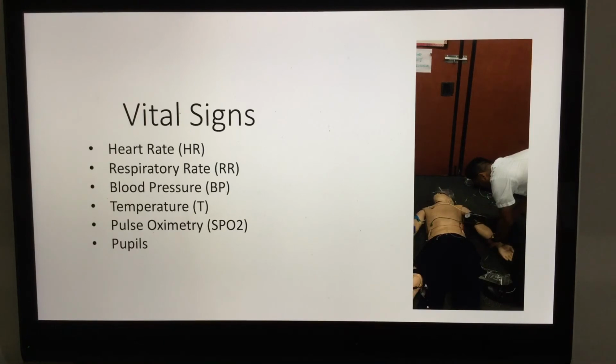So we would like to see our patients with a number above 95%. That would be on room air. Now, if they're less than 95%, we may decide to give them oxygen or to support their ventilation. Again, we would watch the device to make sure that, if we're providing oxygen or even ventilations, we see that number increase from 94 or below to the 95 range.